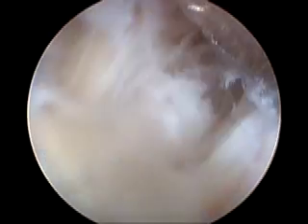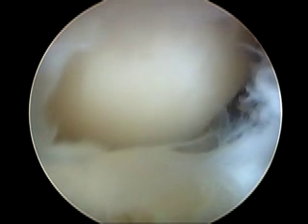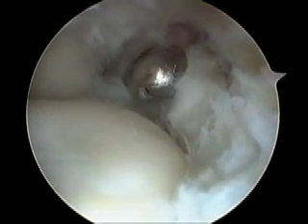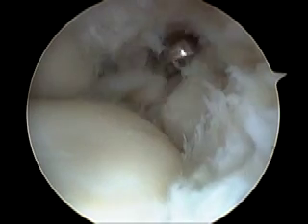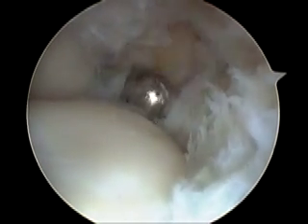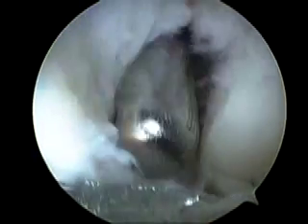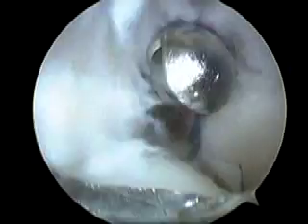So this is his arthroscopy, a very thick capsule. This is a left elbow. We started working from the lateral portal, releasing all the very thick anterior capsule he had. Now we are seeing in the upper part the capitulum and below the radial head. We are removing the lateral parts of the anterior capsule with a shaver, taking a lot of care not to damage the interosseous nerve, and now taking the capsule even with a basket or with a soft tissue shaver, still working from the lateral portal. Now we are working from the medial portal, releasing the anterior capsule until we find the brachialis tendon.